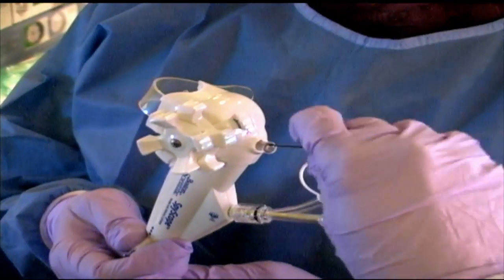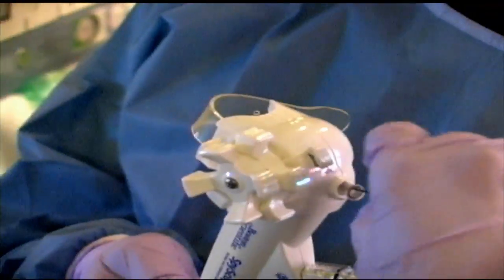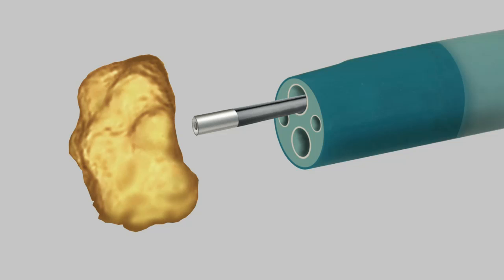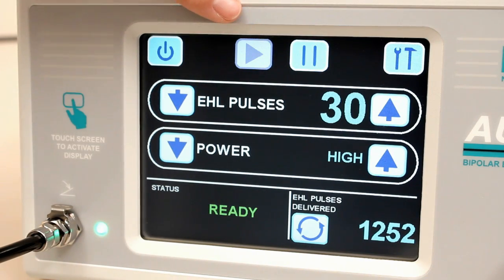To prepare for the procedure, the probe is inserted into the Boston Scientific SpyScope access and delivery catheter using the instrumentation port located near the top of the catheter. Gently feed the probe through the working channel. The probe tip position should be placed one to two millimeters from the surface of the stone and five millimeters in front of the Boston Scientific Spyglass Direct Visualization Probe. Be sure to align the probe tip perpendicular to the surface of the stone. Once the probe is in position and the endoscopic field is infused with saline, a clinician may depress the green arrow symbol to take the unit out of standby mode.